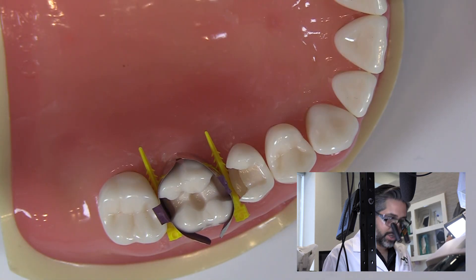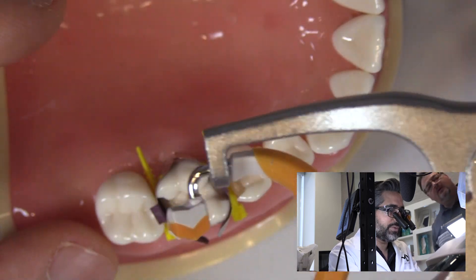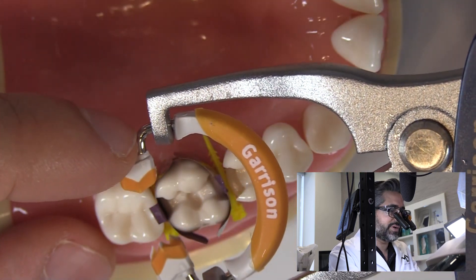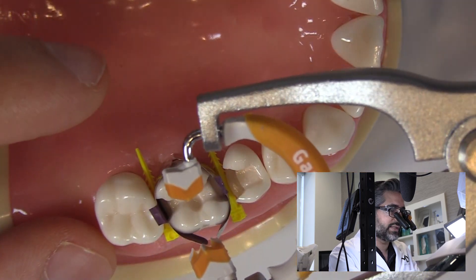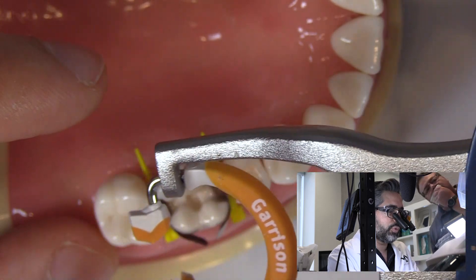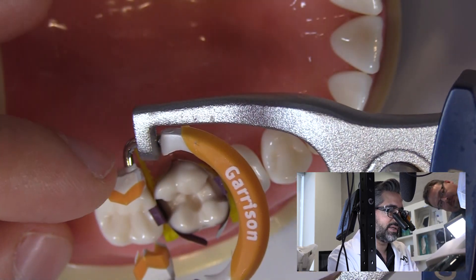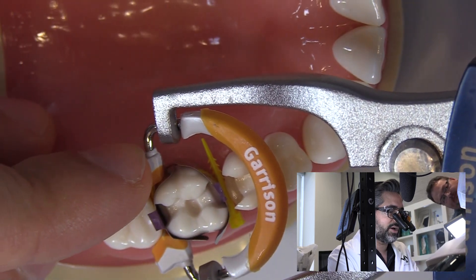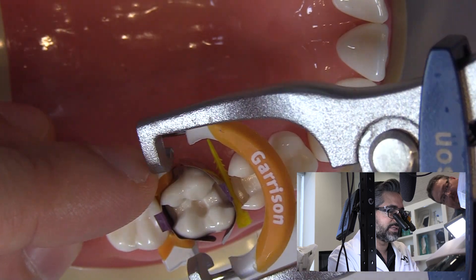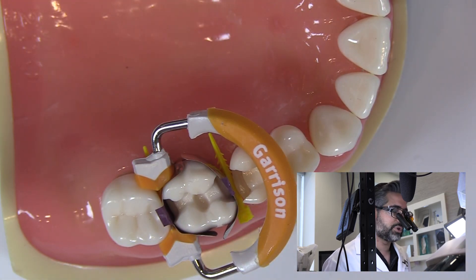When placing the ring, there are a couple of important things. When you come straight down, you're very likely to hit the band, move it, displace it, or create a problem. So what I like to do is come towards the contact that I'm trying to restore. In this case, I'm going to go behind it and slide into place from the distal so that if I contact the band, the tendency is going to be to push it against the tooth — not to push it away, fold it, or crease it.